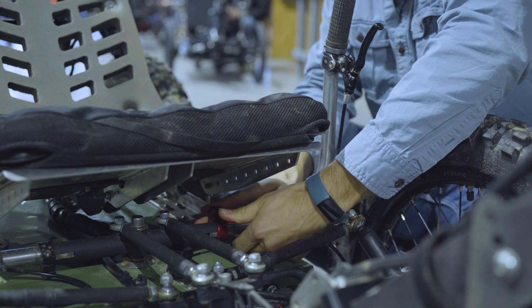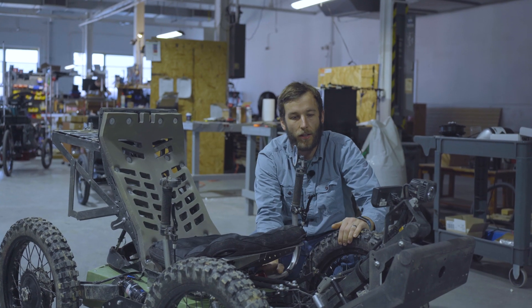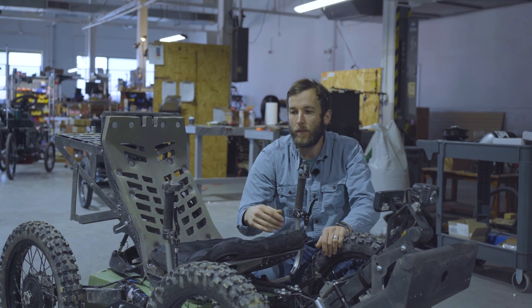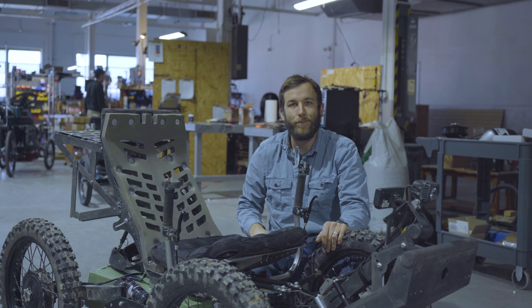Make sure when you fold your quick release lever back down that you've got plenty of tension on that lever so it's solid. Then you're in the cockpit, ready to go. You can release your parking brake and you're ready to ride — enjoy!